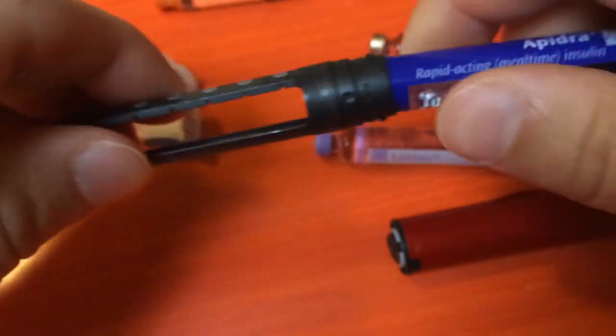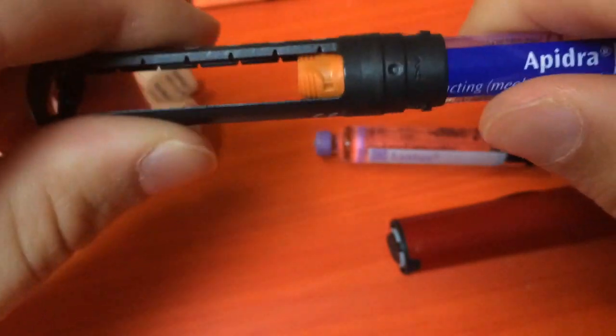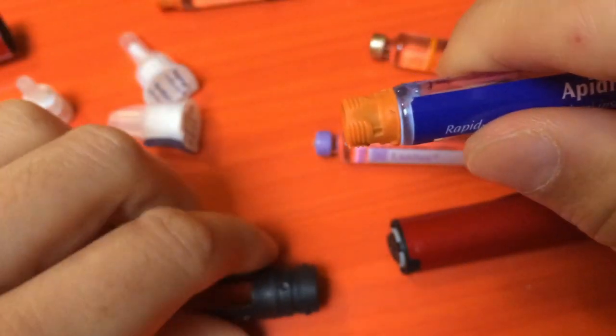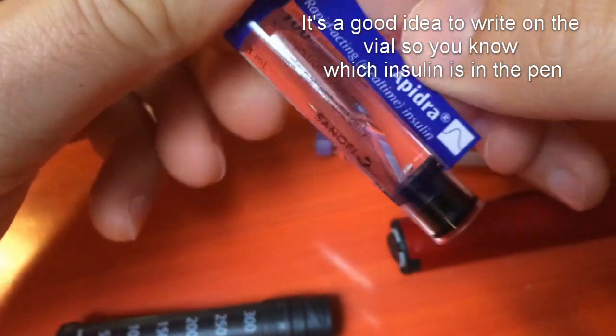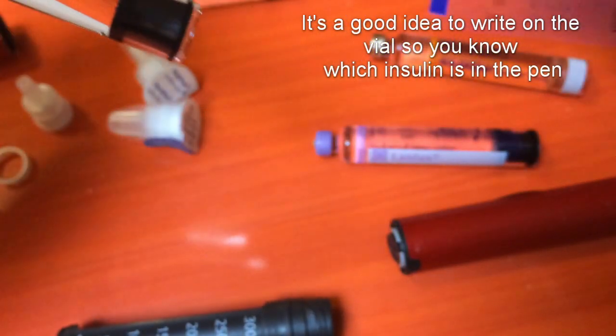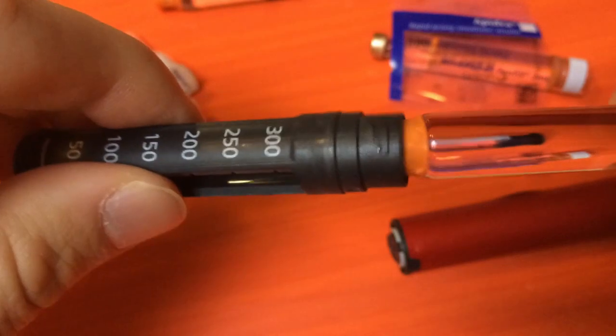Second step: if you try to put an Apidra vial straight in, it's too thick and it doesn't fit. So you take off the sticker, and then it fits perfectly.